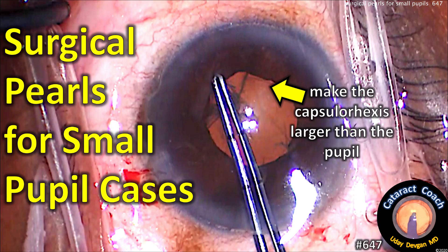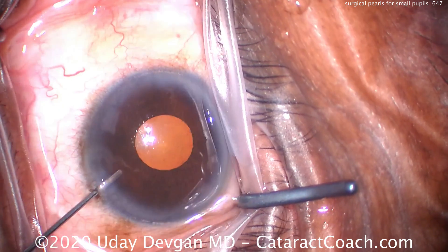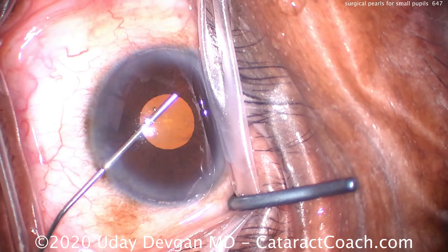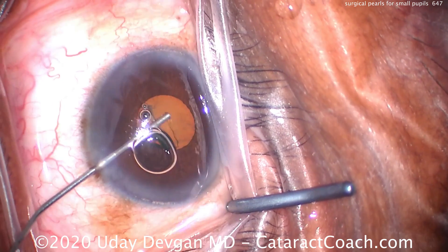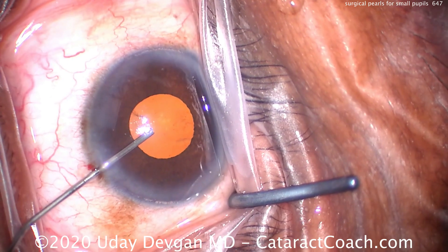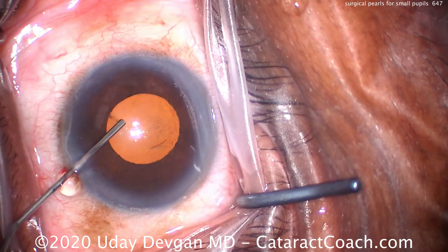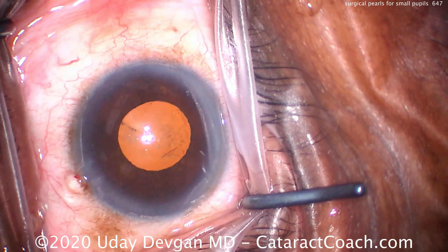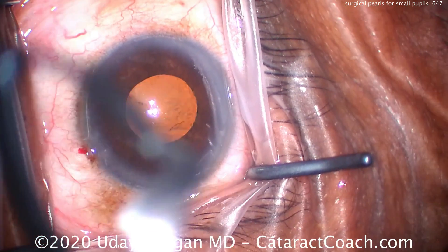Surgical pearls for small pupil cases, such as making the capsularexis larger than the pupil. Here's a pearl: when you inject viscoelastic, let's achieve some viscomydriasis. Osher has taught us this — we want to inject the viscoelastic at the pupil margin to push the iris to the periphery. You can see you can expand the pupil by one and a half, maybe even two millimeters in diameter. That's a significant help.